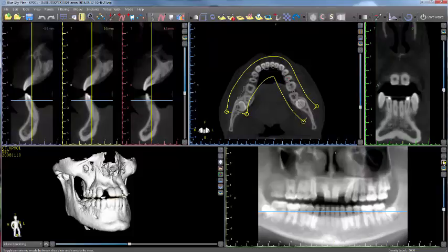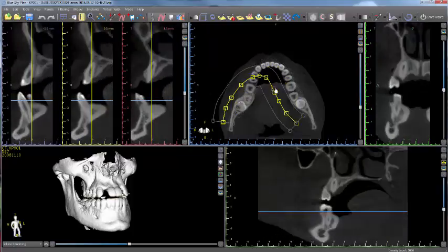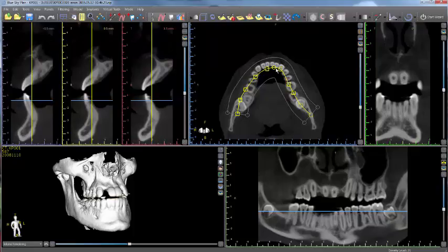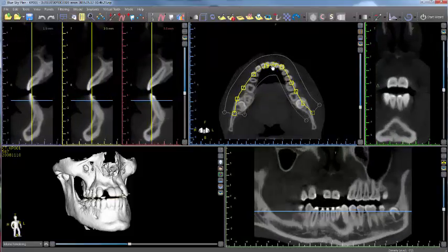Clicking on the center icon changes the emphasis in the axial view, whether it's the two-line composite view or the single slice mode. Dragging the red square control point will move the entire curve as a single unit. Moving the panoramic circular control point will let you expand or contract the entire panoramic curve.